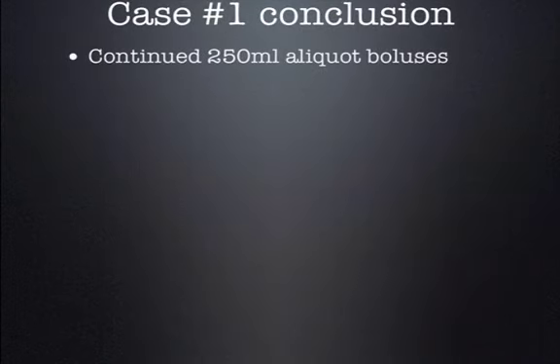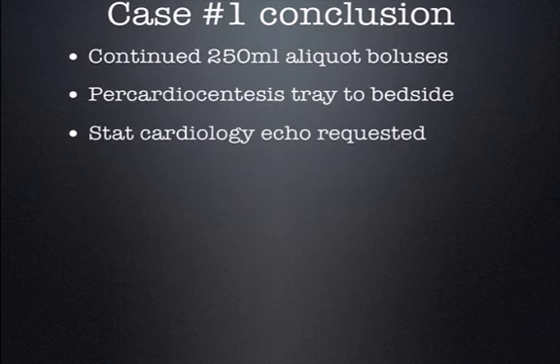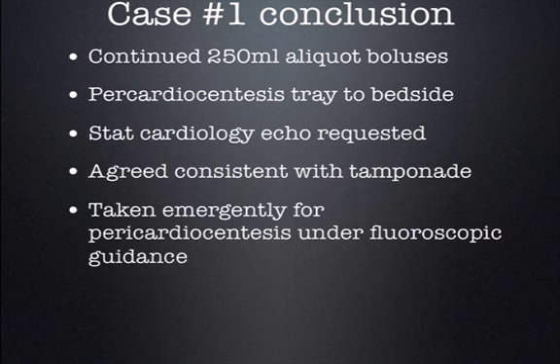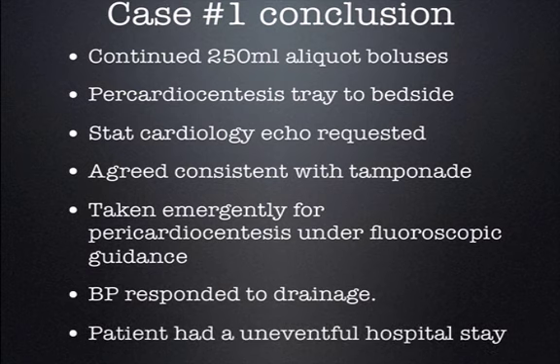We continue 250 ml aliquot boluses. Pericardiocentesis tray was brought to the bedside. Cardiology echo requested, and they agreed this was consistent with tamponade. Patient was taken emergently for pericardiocentesis under fluoroscopic guidance, and BP responded to drainage of the pericardium. Patient had an uneventful hospital stay thereafter.